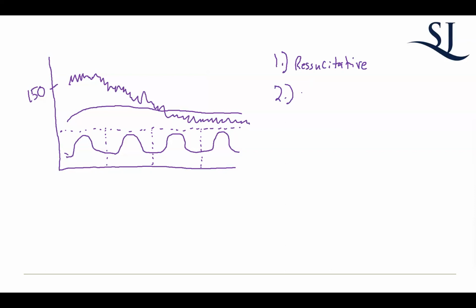Could it be umbilical cord compression? Well, umbilical cord compression will look a little different, and I'll show you what that's about. But head compression will give you early decelerations. It won't give you this. I'll give you a hint. You can see it. What are these doing?